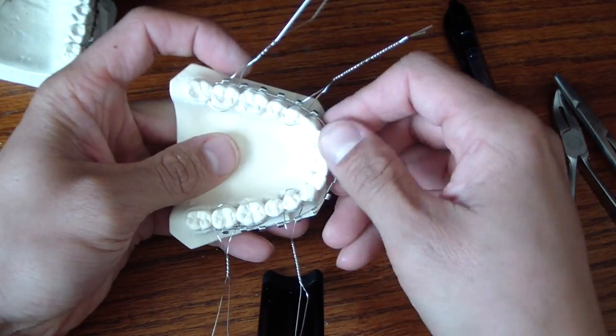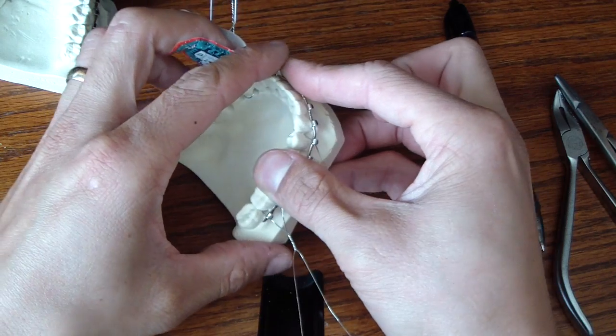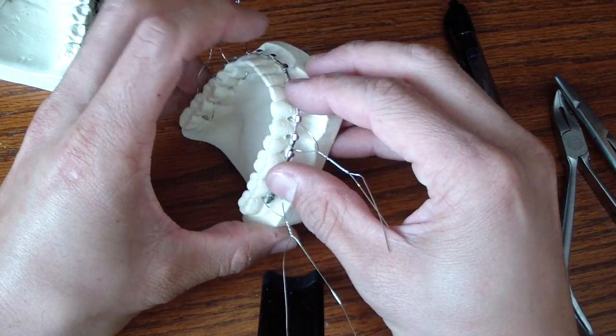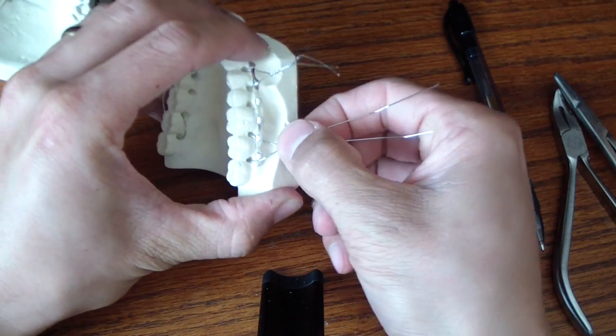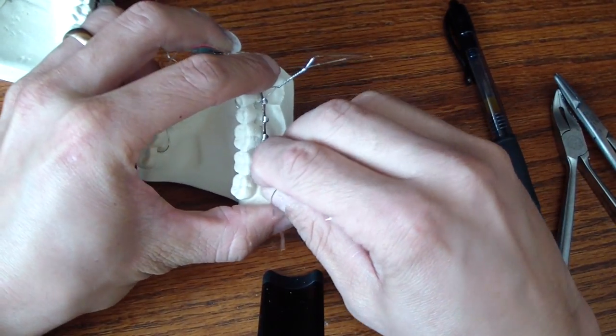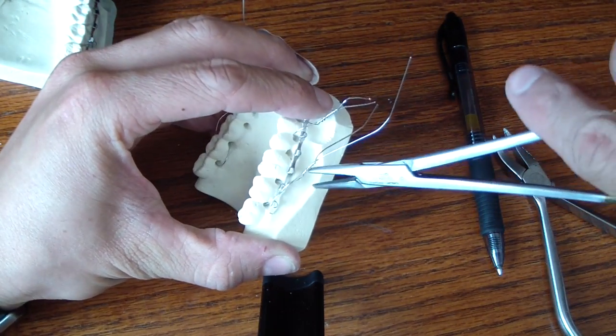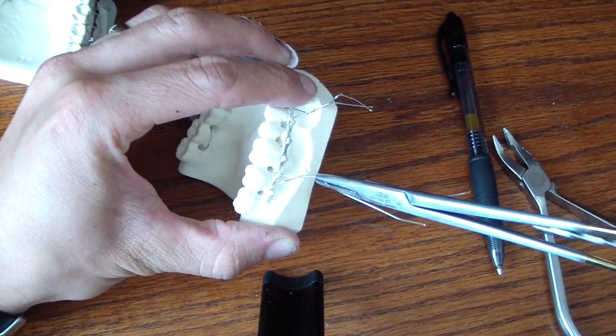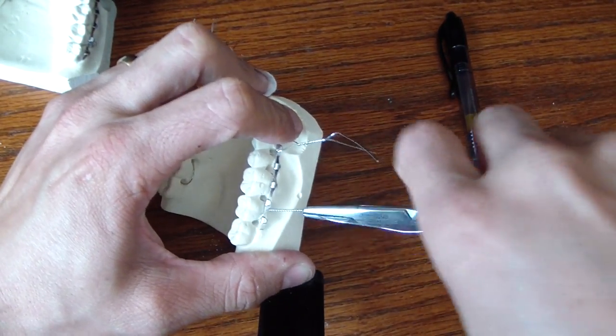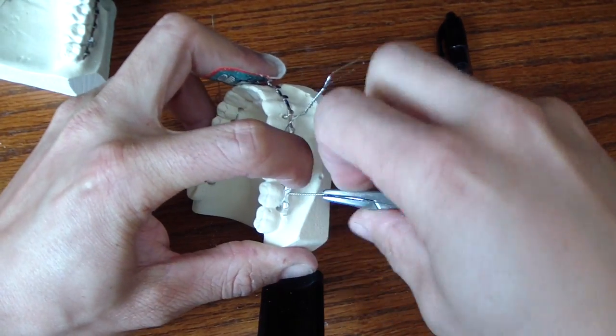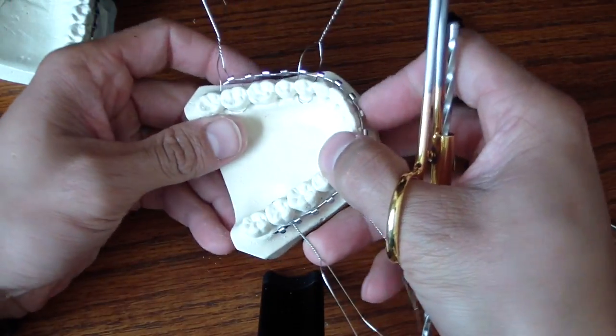Put that through there. Sometimes when you're doing this clinically it's very difficult. It's nice to have two folks, two clinicians doing this. Try to have this distal wire come over the posterior part of this arch bar, but it doesn't always work. We're going to tie this off, make sure it's seated against the tooth and start with that. Now we're going to go around.